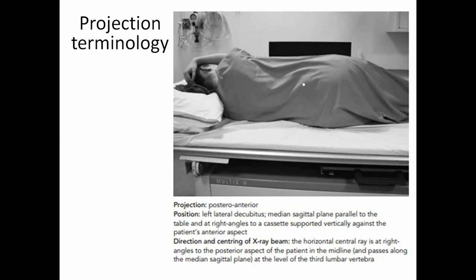This one we also call left lateral decubitus; you can see the left side of the patient is touching the table. We take these views when a fluid level, pneumothorax or hemothorax is suspected. In such cases these two views will be taken. I will explain further projections next.